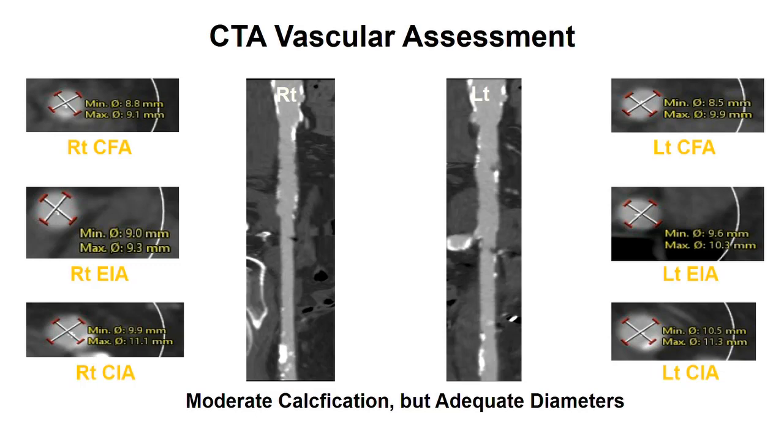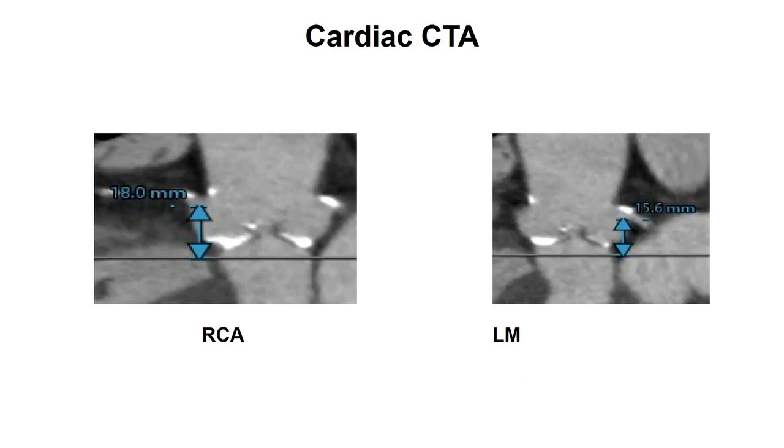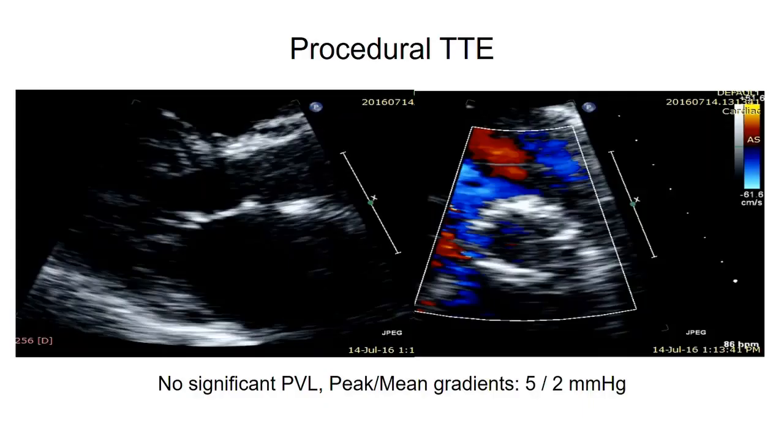So this CTA vascular assessment is really critical for us, as well as determining what valve size we are going to use, how eccentric and elliptical the annulus is, how much of this is calcified, and how much is involving LVOT calcification. Now, during the procedure, we started with TEE, but now we're using more TTE, except for very specific questions. And here is a case with no significant PVL, which is what we want to hear before we take the patient off the table.